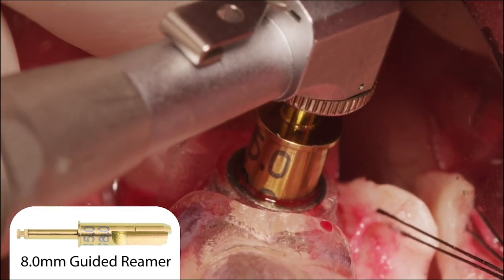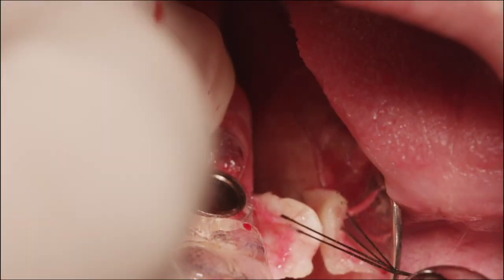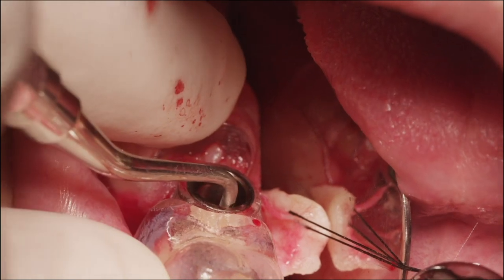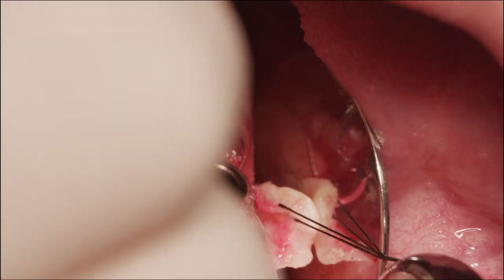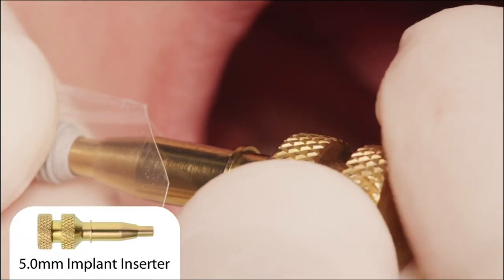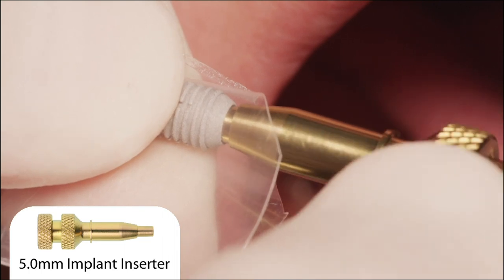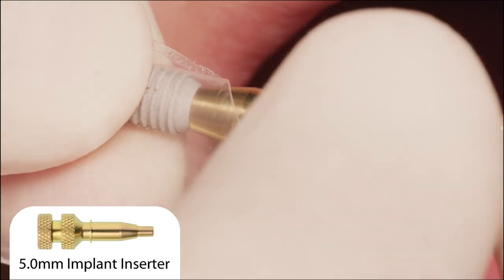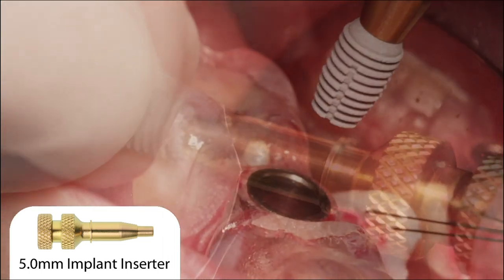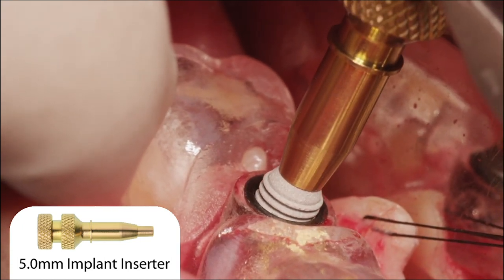Once the intended depth has been reached, a curette is used to confirm the five walls of the osteotomy and to ensure there is no remnant material that could prevent the implant from being fully seated. Using the sterile packaging, engage the implant to the implant inserter and turn the barrel until it sits flush with the top of the implant. Place the implant through the guide until it is fully seated.